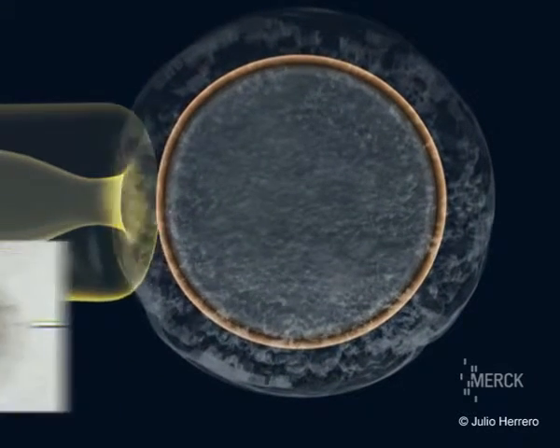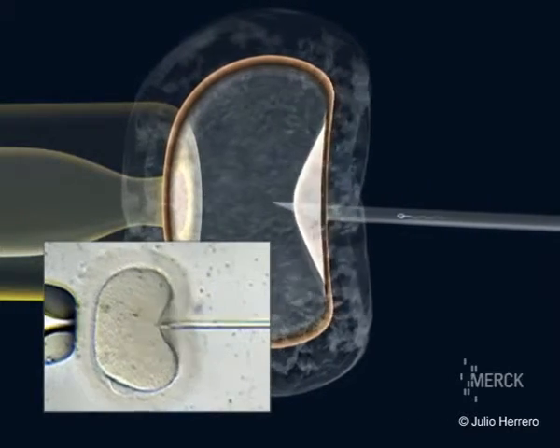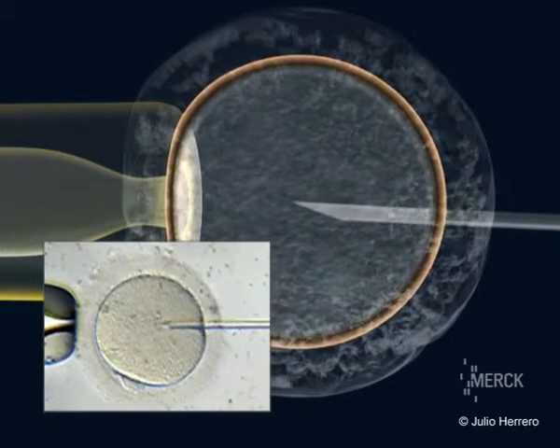The oocyte is fixed with a micropipette and the other side is pinched by the needle, and the sperm is injected into the oocyte.